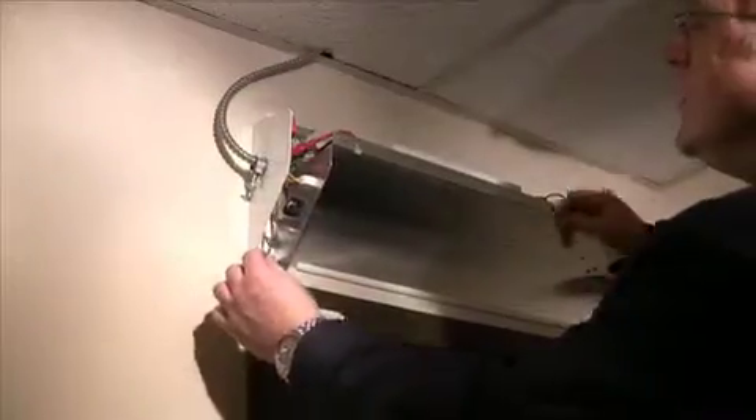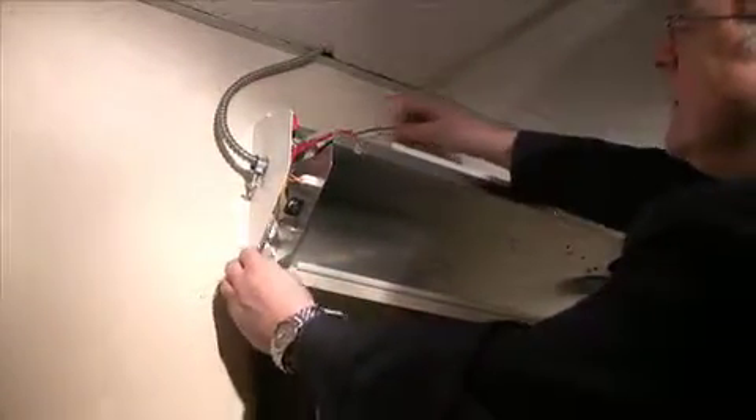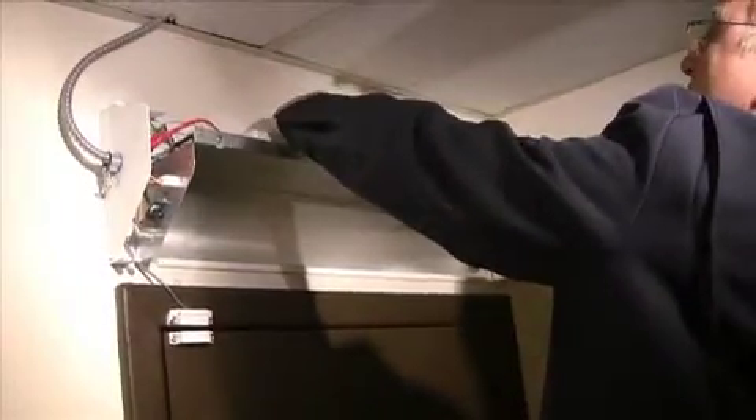Install the unit door contacts on both door and frame. This can be mounted either side of the disinfection unit. Upon door opening, pull any remaining wires back inside the unit to remove any excess wire outside the unit.